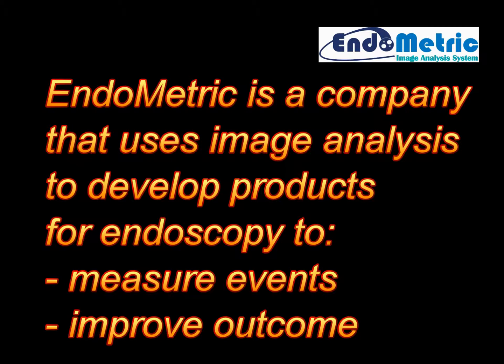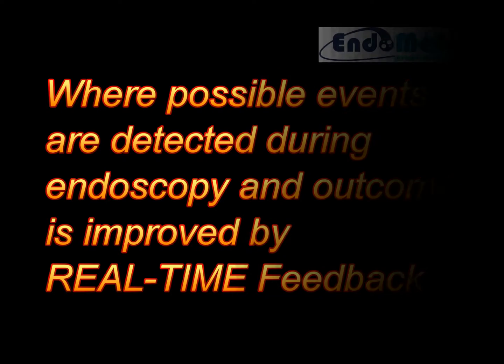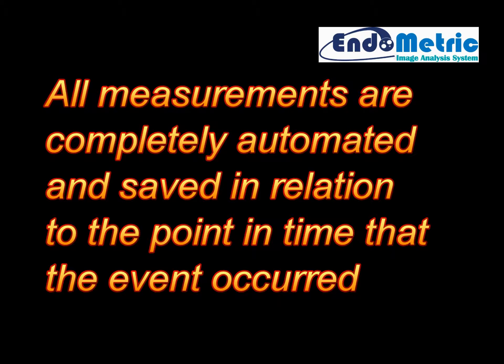EndoMetric is a company that uses image analysis to develop products for endoscopy to measure events and improve outcome. Where possible, events are detected during endoscopy and outcome is improved by real-time feedback. All measurements are completely automated and saved in relation to the point in time that the event occurred.